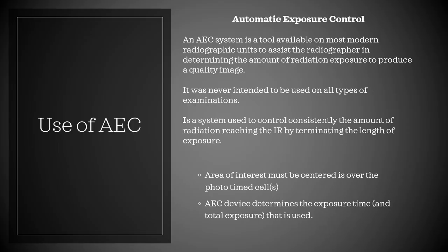Automatic exposure control. An AEC system is a tool available on most modern radiographic units to assist the radiographer in determining the amount of radiation exposure to produce a quality image. It was never intended to be used on all types of examinations. It is a system used to control consistently the amount of radiation reaching the IR by terminating the length of exposure.